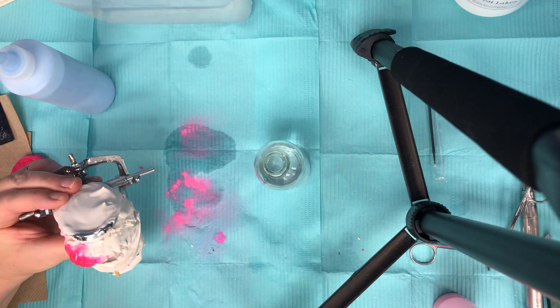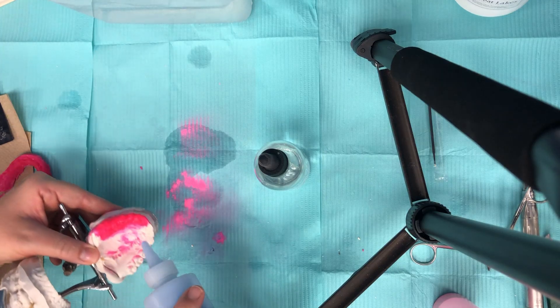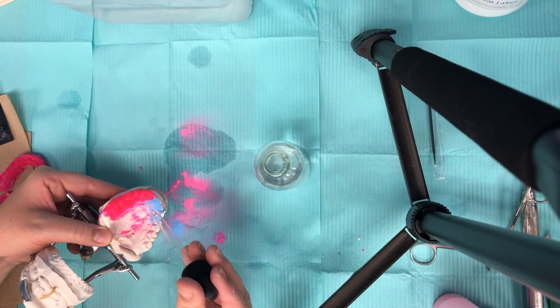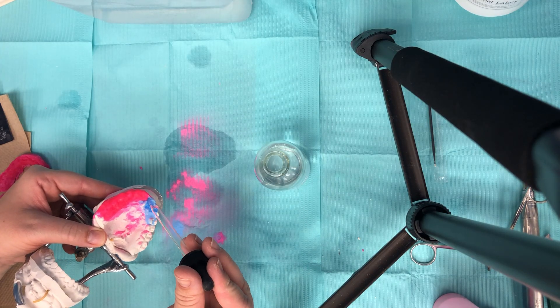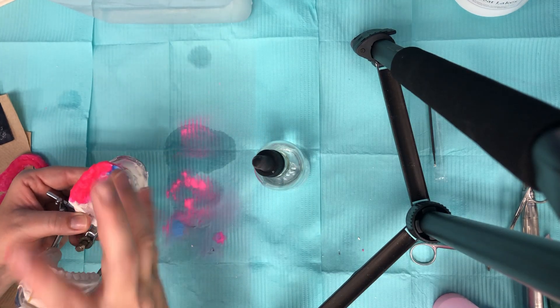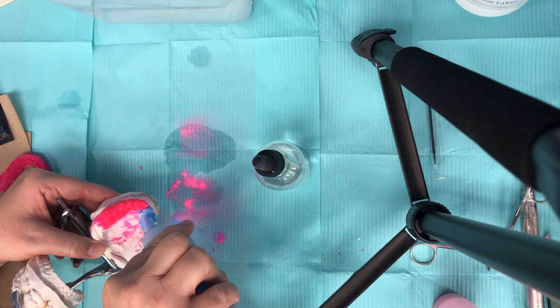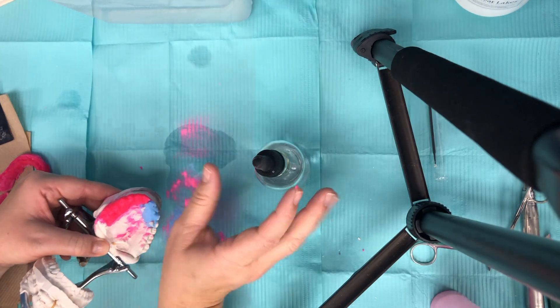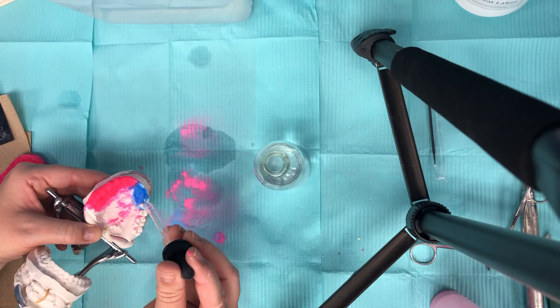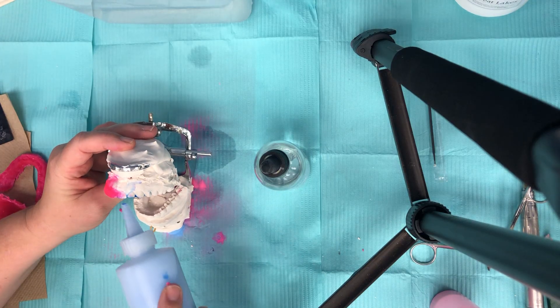All right, now let's switch gears and go to the patient's left side. Put the blue on there on the lingual surface. Remember that everything that the tongue touches when the teeth are biting together is touching the lingual surface — the inside. Let's go to the facial.